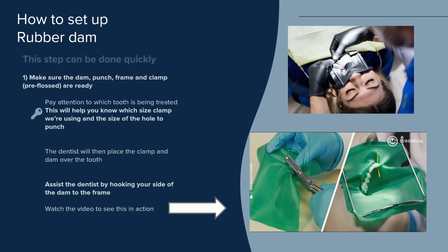Assist the dentist by hooking your side of the frame. And let's watch this video. Let's see if it plays perfectly. I'll go over clamp sizes in a minute.